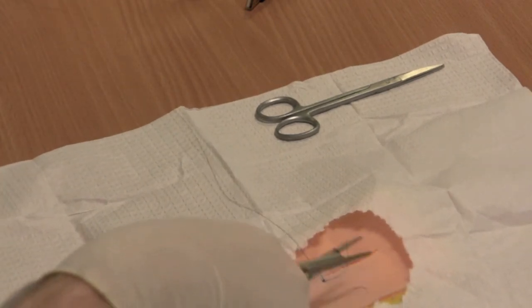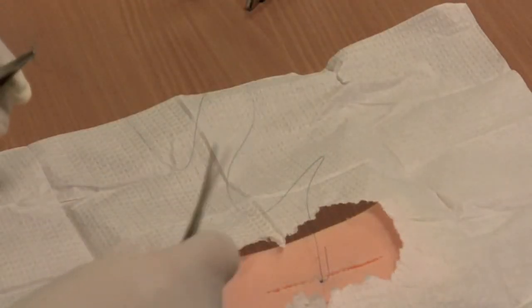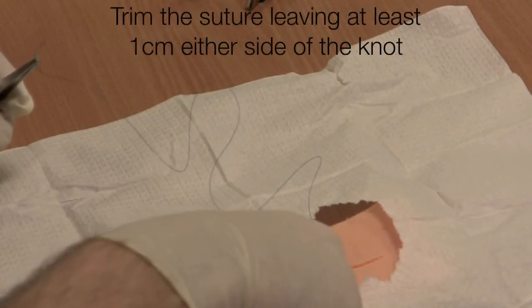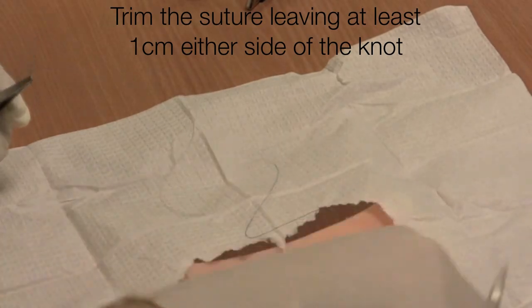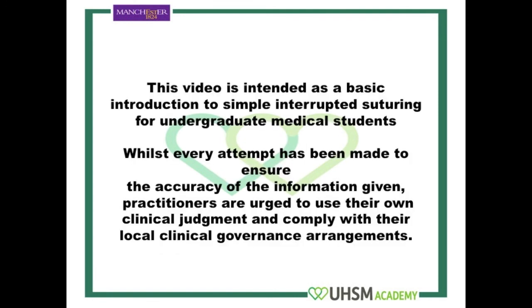If necessary you can adjust the tightness of the suture at this stage. Taking the scissors, trim the suture, leaving at least one centimetre on either side of the knot.